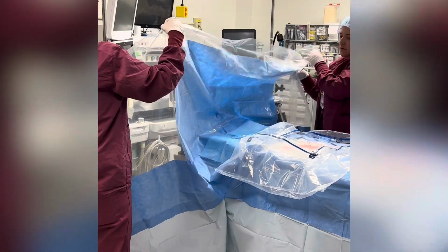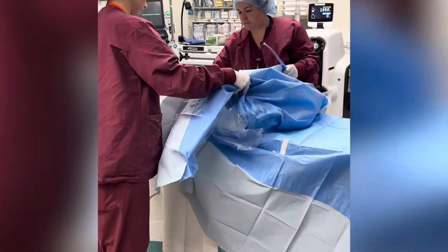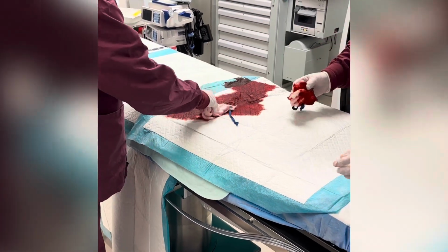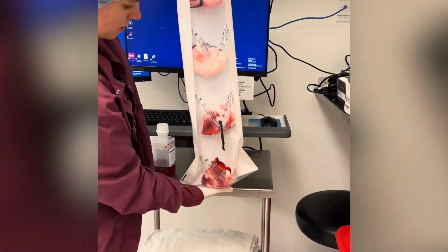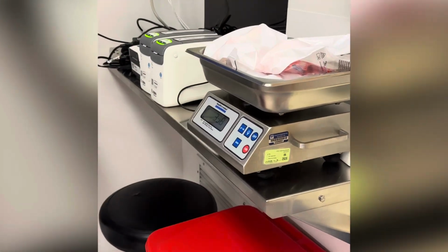Almost done. As the drape comes off, remember we must clean the patient and do our first fundal. Some of those laps used include the irrigation fluid that was already accounted for in the 1,000 mLs of normal saline. As we weigh our final set of laps, notice we are only weighing 5 laps this time for a total weight of 339 grams.